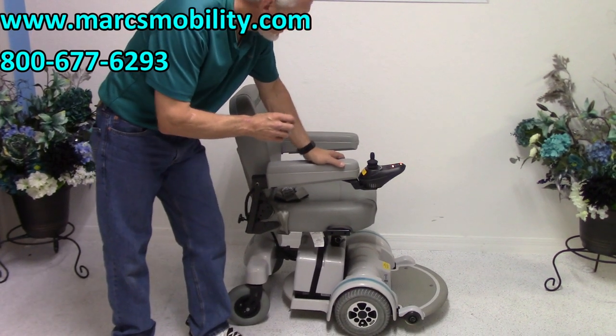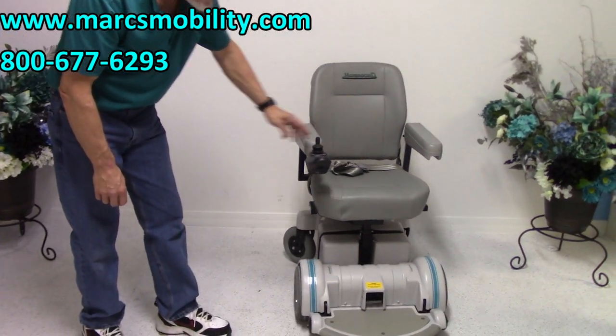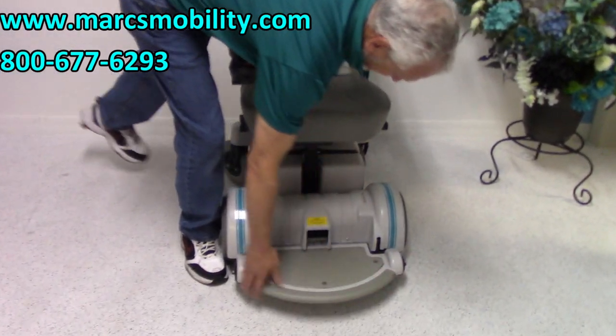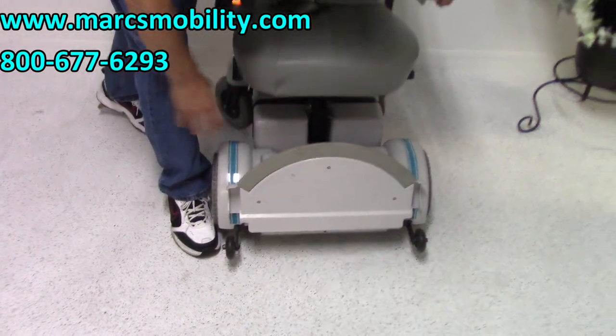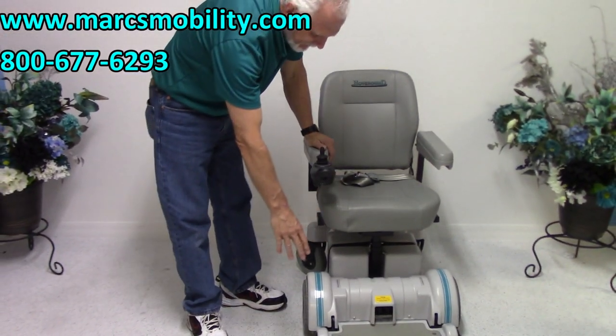So it's the Hoveround MPV5, and what they say is famous about this power chair is that it's the only chair that's got a rounded footplate. Most chairs have a square footplate. This is a rounded footplate, and you can raise it up like this when you exit the chair, so you can exit this way.